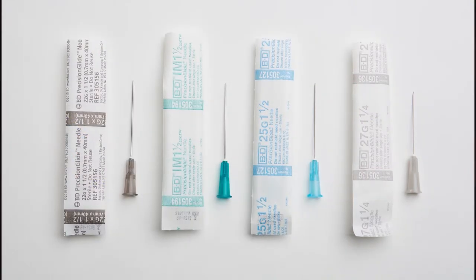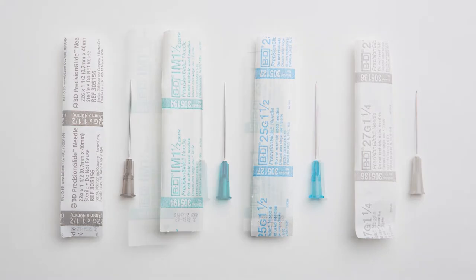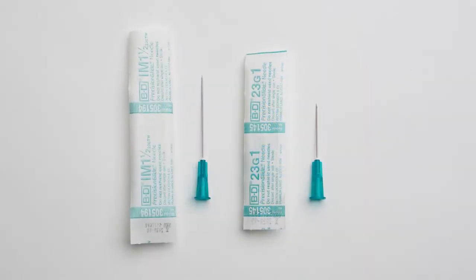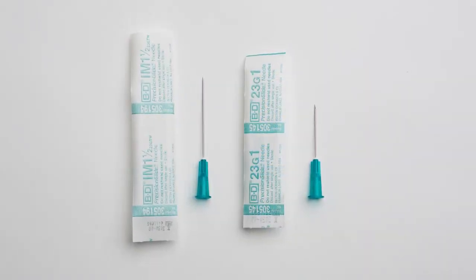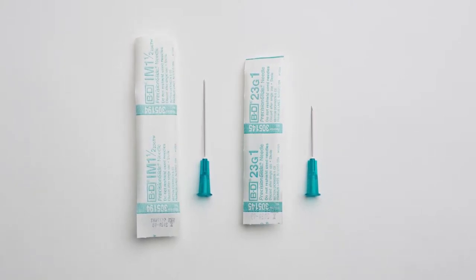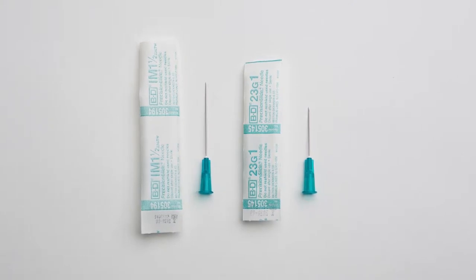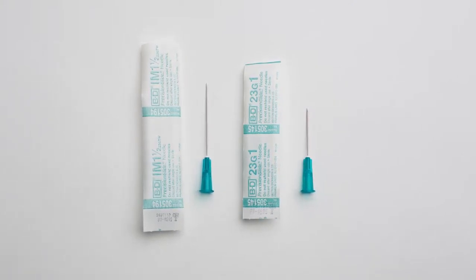Needle gauge typically varies from 22 to 27. In our practice, we most commonly use 23 gauge, one inch needles for palpable targets. If large or deep seated lesions are sampled, longer needles may be needed. For ultrasound-guided FNA, one and a half inch needles are used most often.